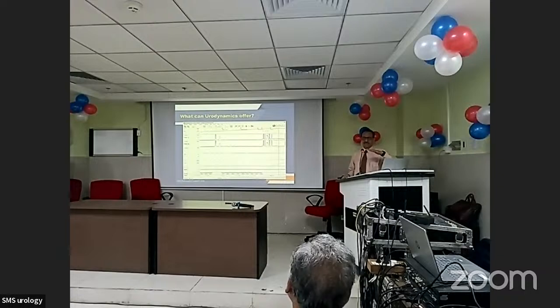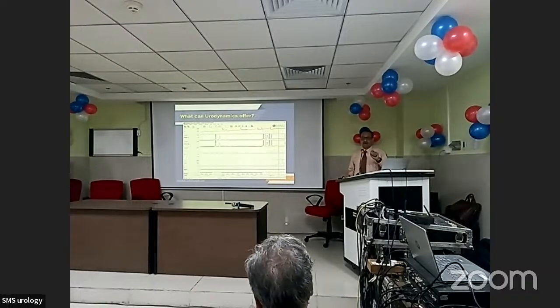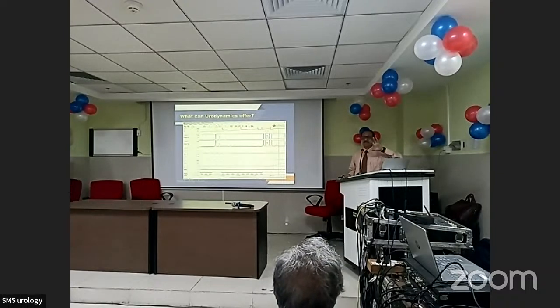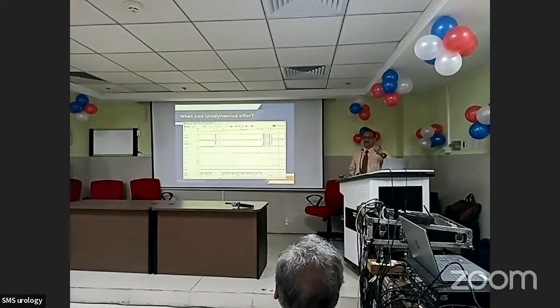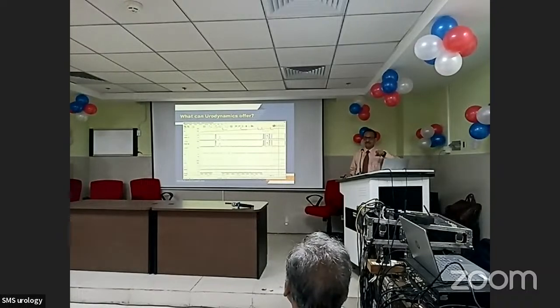So, detrusor pressure is a response of force of detrusor contraction and outlet resistance. That is the reason we say that outlet obstruction is characterized by high pressure and low flow. Why? Because the detrusor is contracting normally, but the resistance it encounters is so high that high pressure is generated in the bladder. It does not necessarily mean that the bladder is strong. I mean, maybe, but it doesn't mean that.